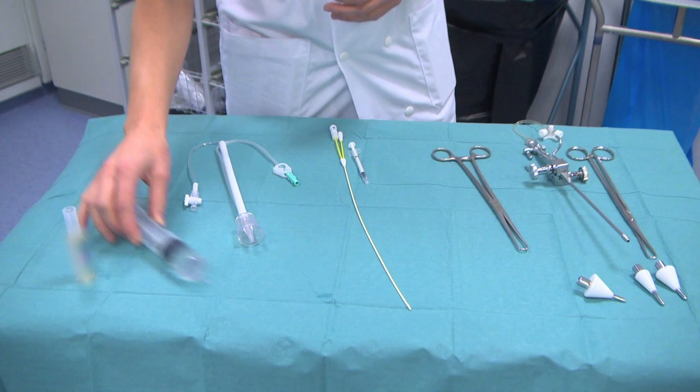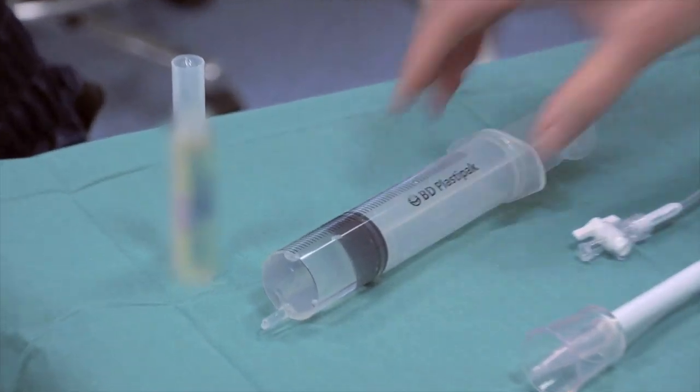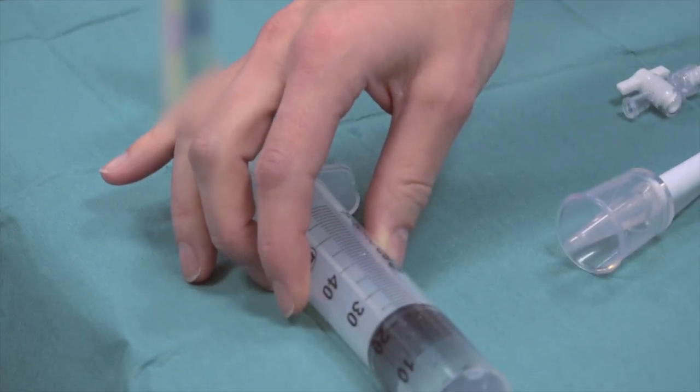First of all, we're going to start with the contrast putting into the syringe. It's 20 cc.